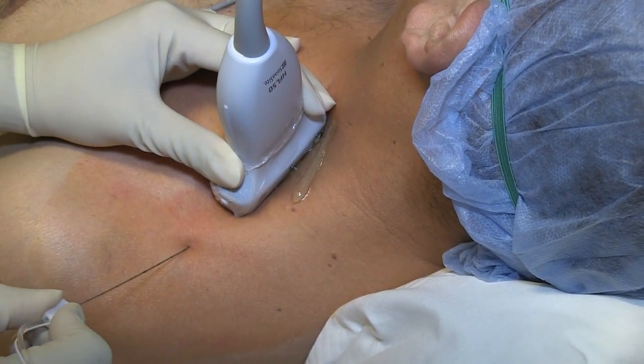Today we're going to discuss the use of ultrasound for supraclavicular nerve block and look at some clinical tips to help you improve your success rate.